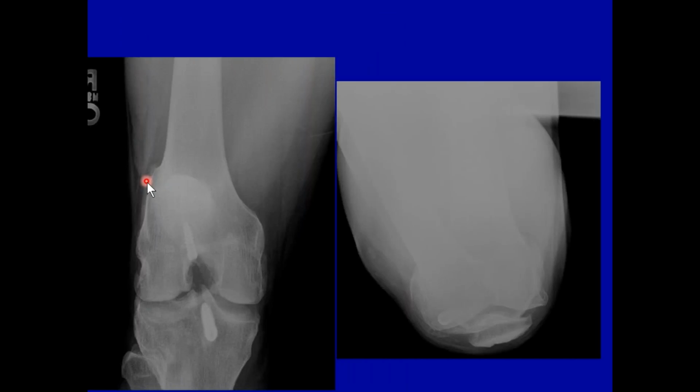If a patient comes in who has had an ACL tear and they've done ACL reconstructive surgery, you might be asked to do a tunnel view. So you never know who's coming into your office, what kinds of entities they are afflicted with. So this is just an example I'm using. These are plastic plugs where they reattached into the femur and into the tibia the ACL graft that they may have taken from the hamstring tendon.